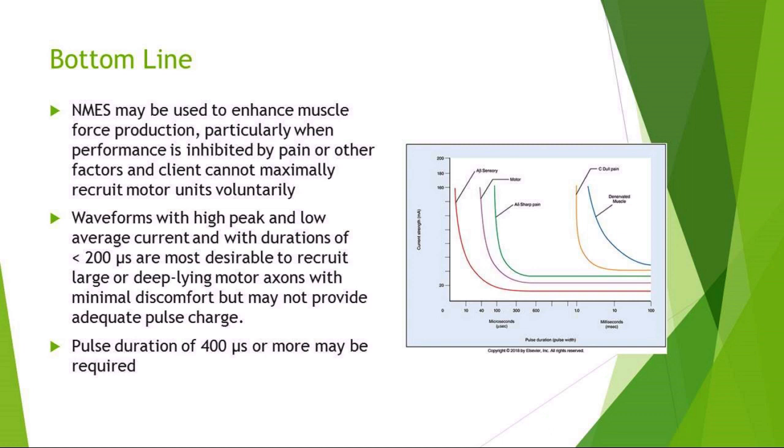Bottom line, NMES may be used to enhance muscle force production, particularly when muscle performance is inhibited by pain or other factors, or when the client cannot maximally recruit motor units voluntarily, so post-surgically in a knee patient. That's a really common post-surgical intervention.